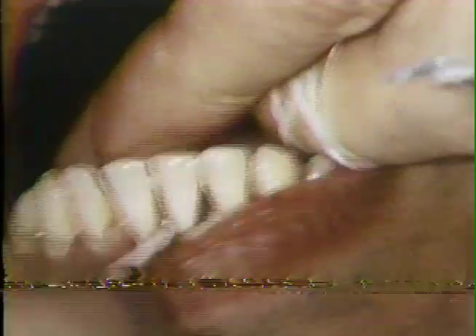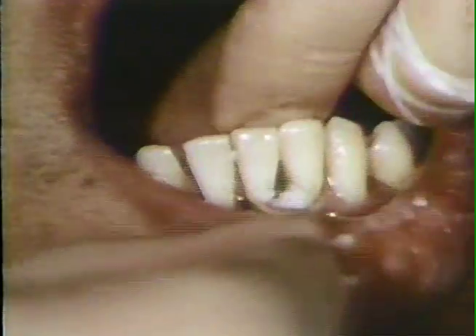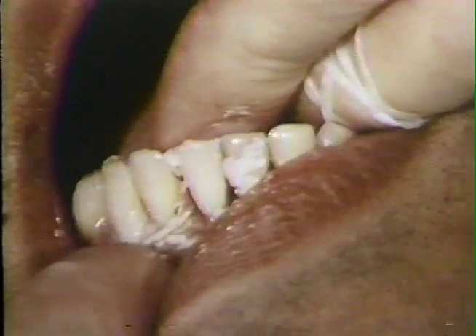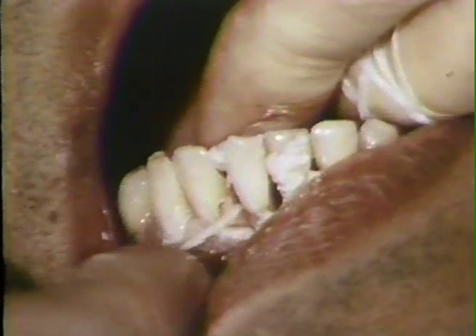The most common method for interproximal polishing is the use of dental tape and polishing paste as shown here in the mandibular incisor region. This is somewhat time-consuming, but is effective in polishing the interproximal surfaces of teeth.